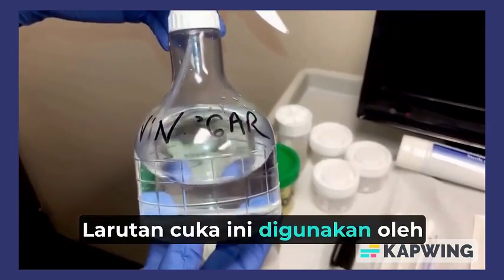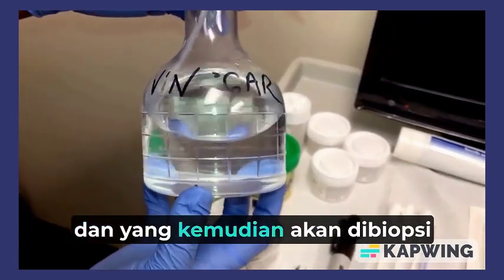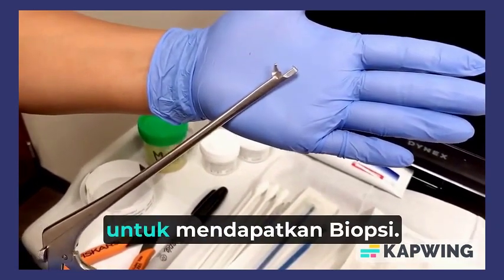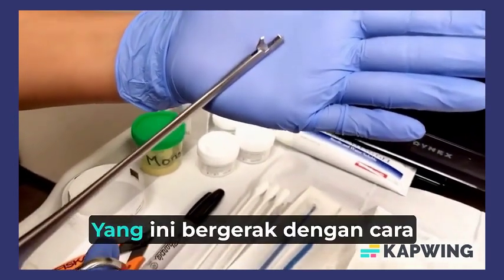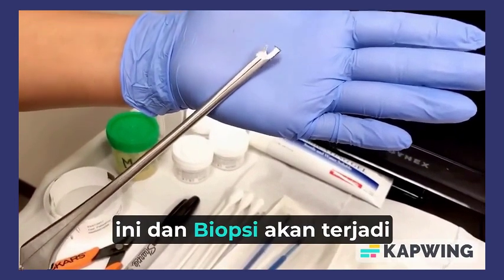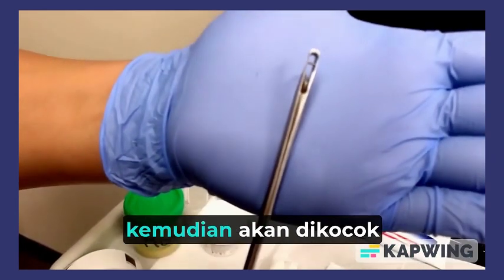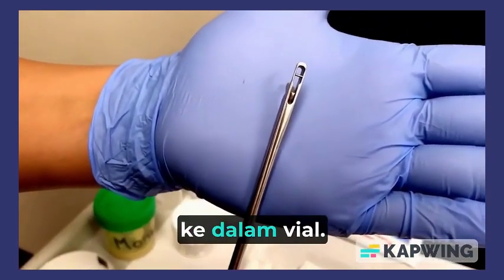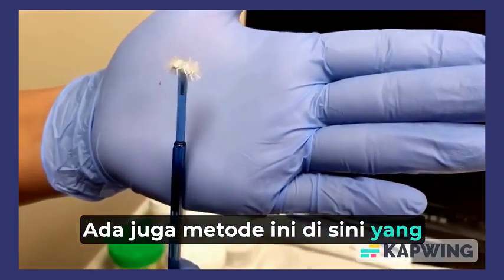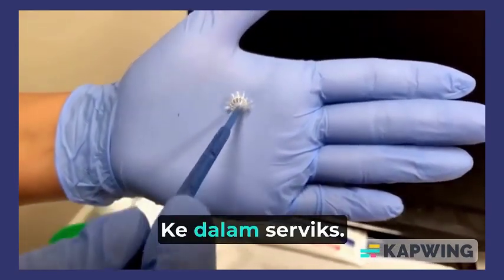This vinegar solution is used by the provider to highlight any areas of concern and which will then be biopsied by the provider. The provider has two methods of obtaining a biopsy. This one here moves in this fashion, and the biopsy would then be collected in the bottom, which would then be shaken off into the vial. There is also this method here, which has bristle-like ends and would be used in this fashion onto the cervix.